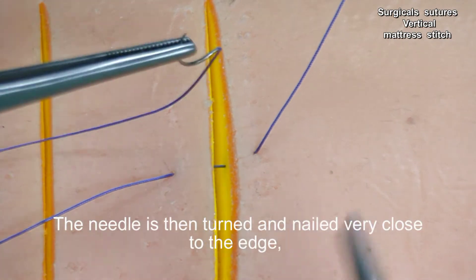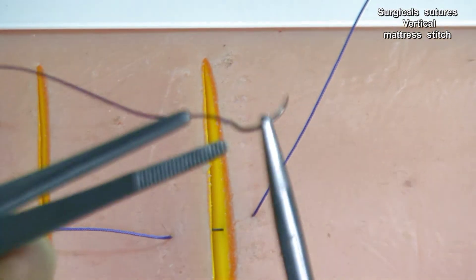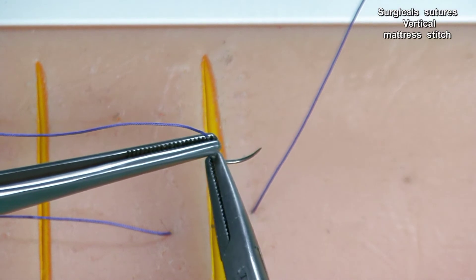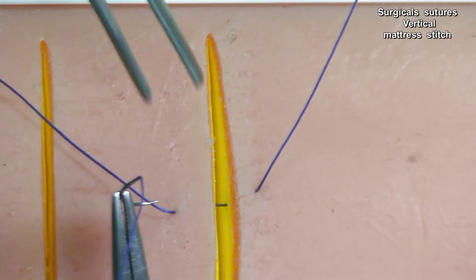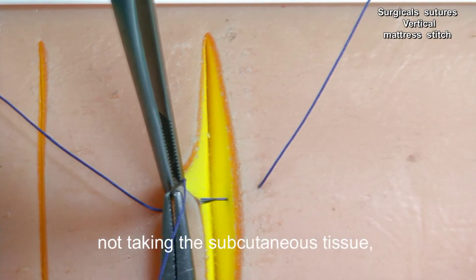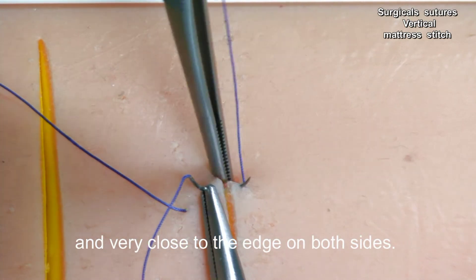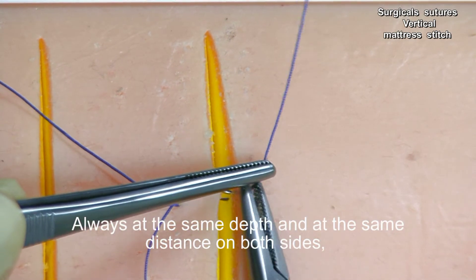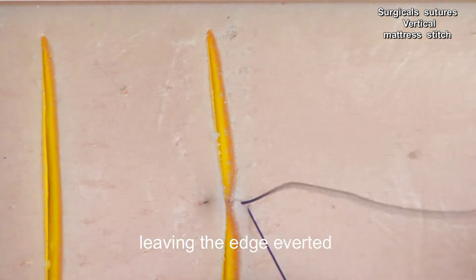The needle is then turned and inserted very close to the edge, superficially — just taking the epidermis and then dermis, not taking the subcutaneous tissue, and very close to the edge on both sides. Always at the same depth and at the same distance on both sides, leaving the edge everted.